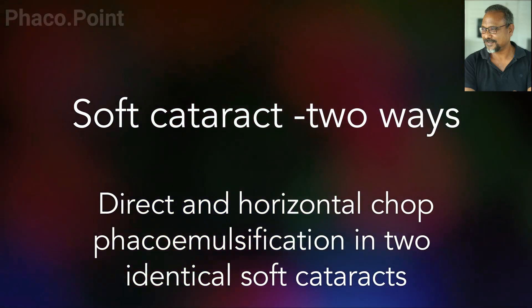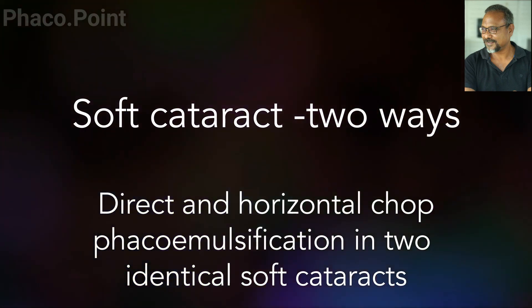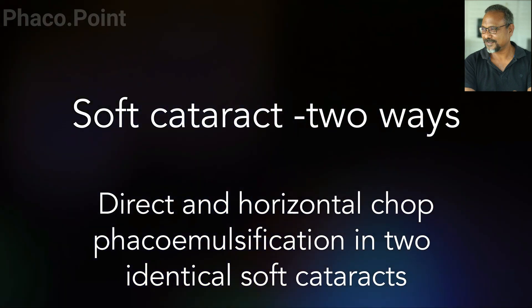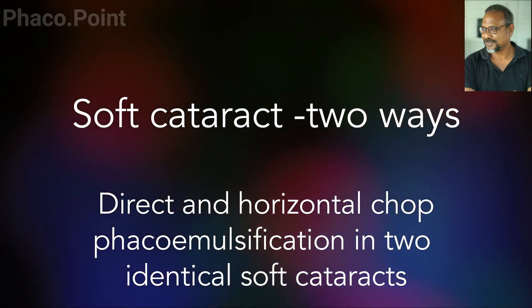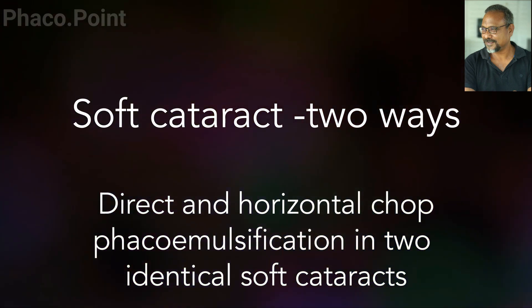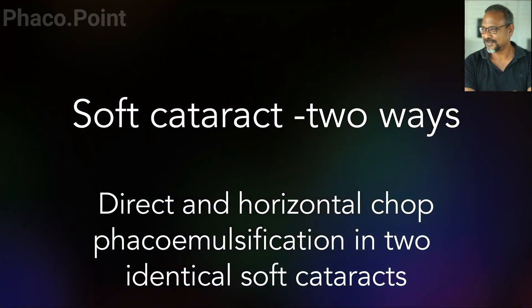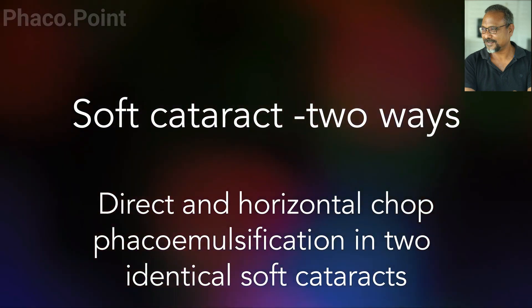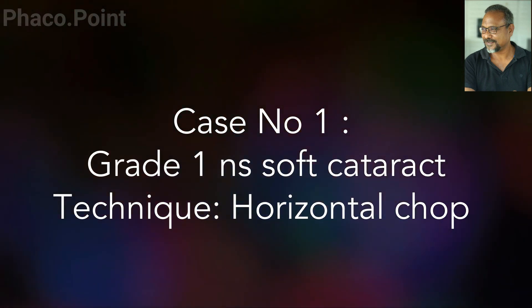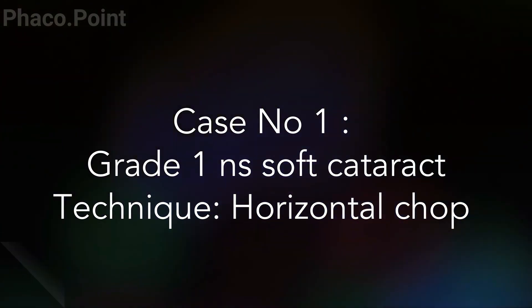My dear friends, today I'm going to show you how to handle a soft cataract two ways: firstly by the horizontal chop technique, and secondly by a direct chop or the direct vacuum chop technique. Let's see how this goes and what lessons we can learn from observing these two cases. Both these soft cataracts were similar or identical to each other. Case number one is handling a soft cataract using the horizontal chop technique.